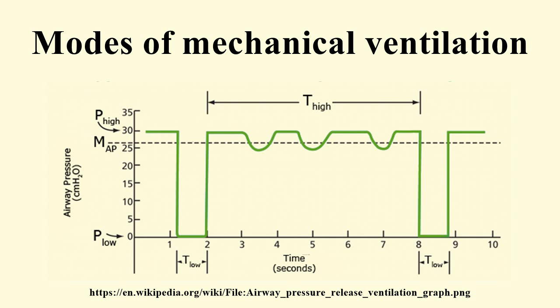single inspiration. Biovariable: a targeting scheme that allows the ventilator to automatically set the inspiratory pressure or tidal volume randomly to mimic the variability observed during normal breathing. Servo: a targeting scheme for which inspiratory pressure is proportional to inspiratory effort. Adaptive: a targeting scheme that allows the ventilator to automatically set one target to achieve another target.